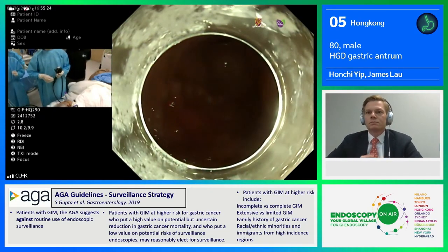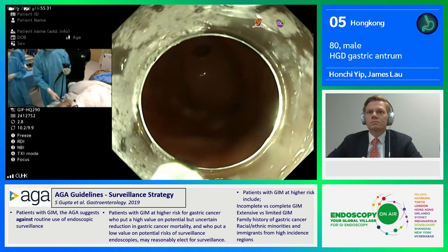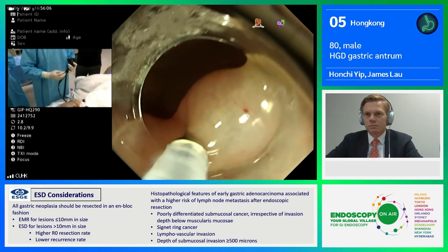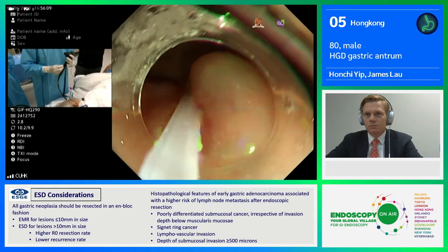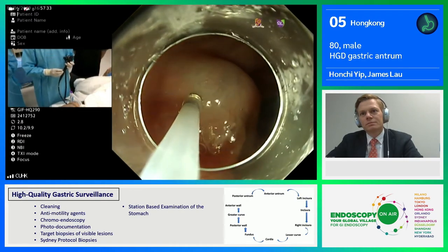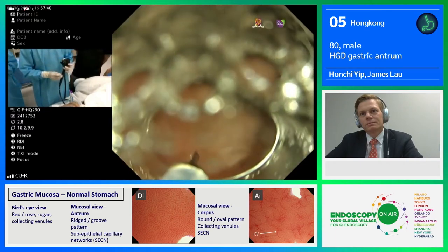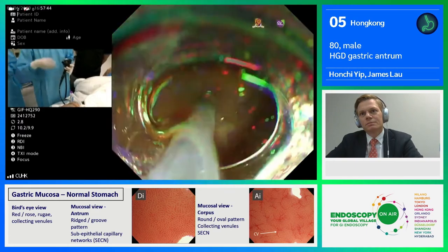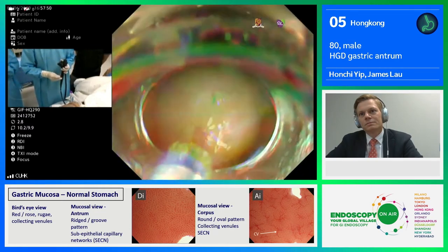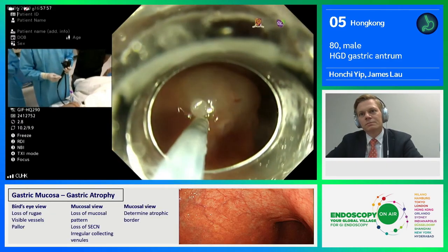At the same time, incision will start on the far side, because I generally use the IT2 knife for gastric ESD. We start injection in the periphery of the lesion. I would do full circumferential injection because gastric ESD is generally okay with that. I would not do circumferential injection for a colonic lesion, because colonic lesions are more difficult to control and the space is much less than the stomach. For gastric ESD, it's also generally okay to do circumferential incision at the start, but not for colonic ESD.